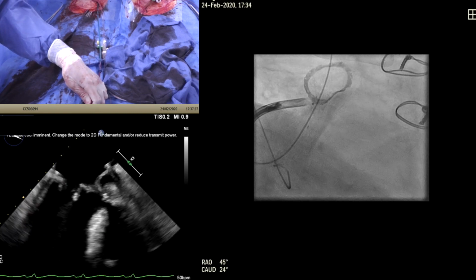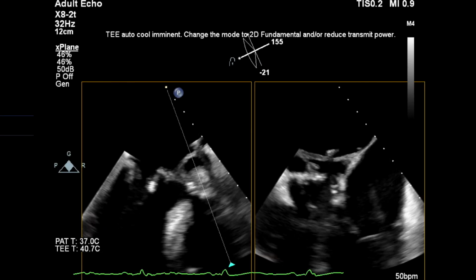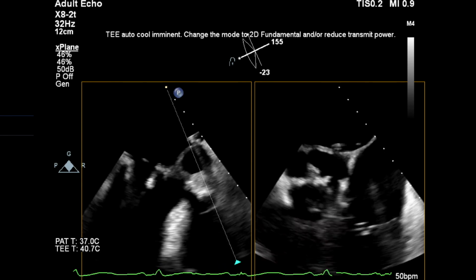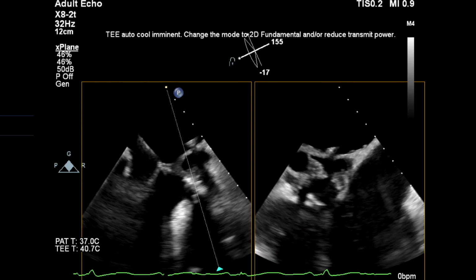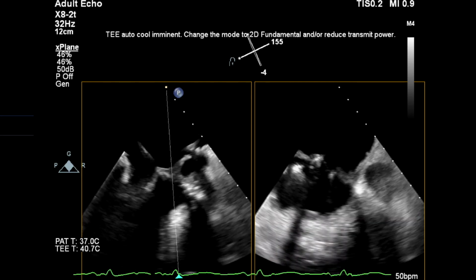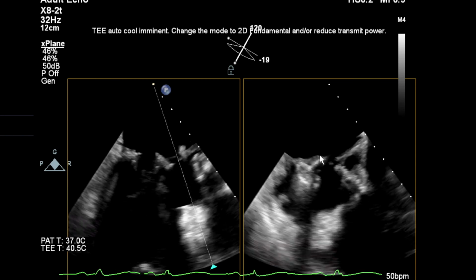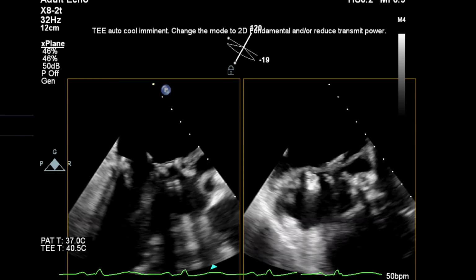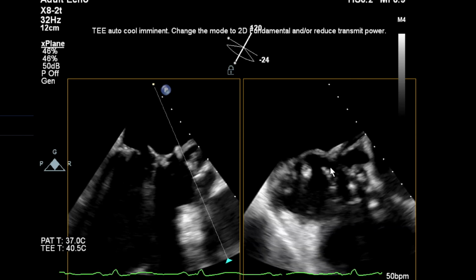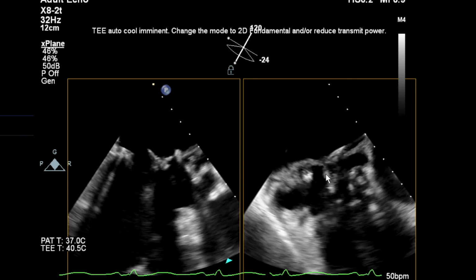I don't want to catch the aortic. I think I'm below the aortic, so I think we should be all right. Yeah, so I think that's caught. I can see that is caught on that ledge of the aortic crown. I'm just below the aortic valve. Look, you've got tissue here. If I move, there's the edge of that big lump, and another edge there, so it looks like you haven't quite caught it there.